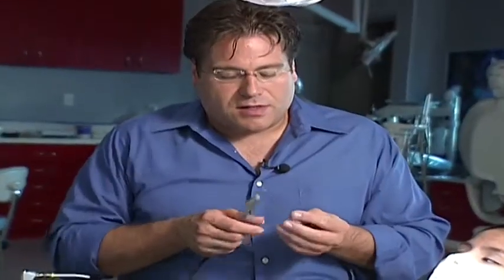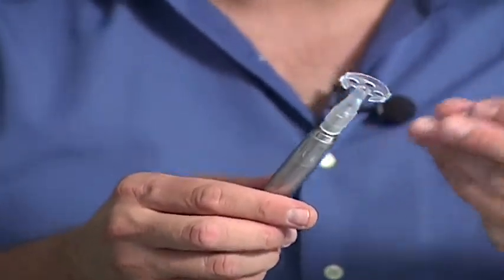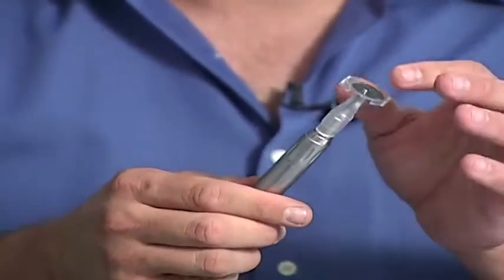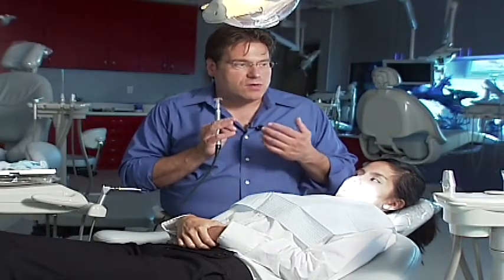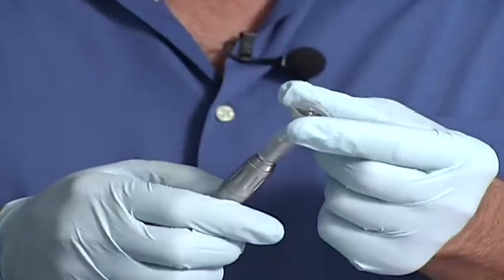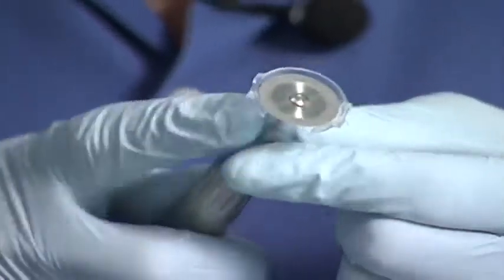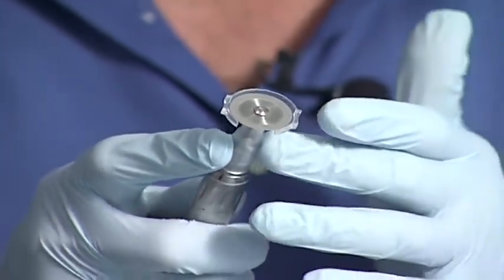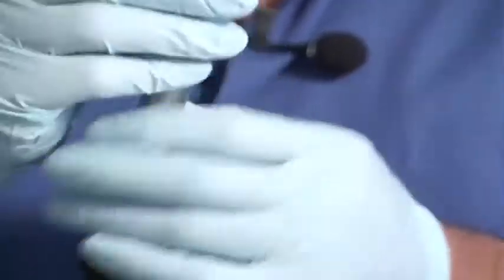The third component is the clear disc guard, which fits onto the motor and handpiece, allowing the disc to go into a plastic clear sleeve. This gives the doctor control, safety for both patient and doctor, and reproducible results. The system slows the disc down from the traditional high speed to a slower speed with a lot of power, allowing you to get through the interproximal surface.